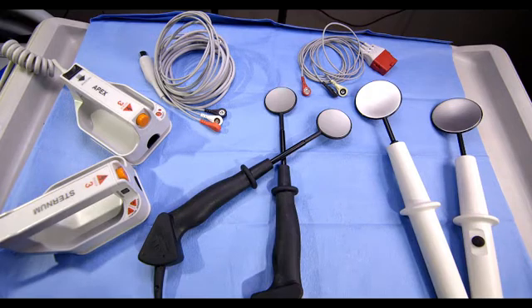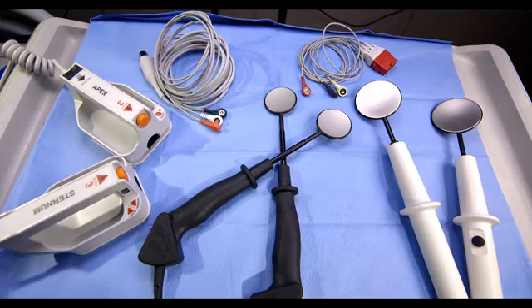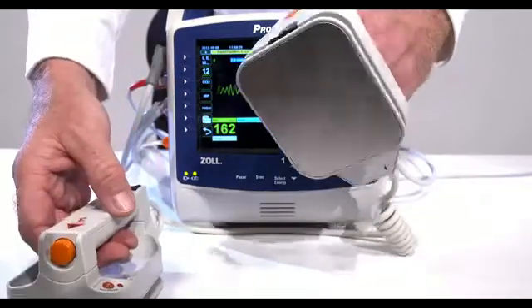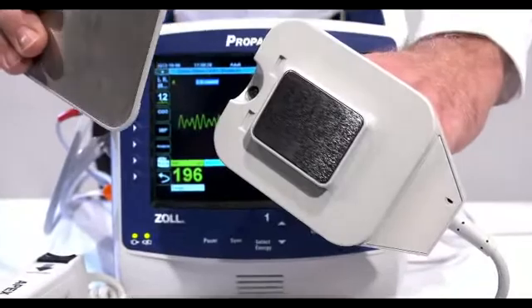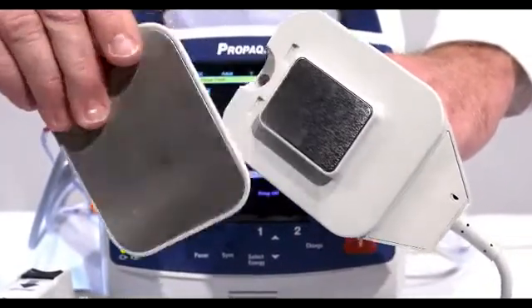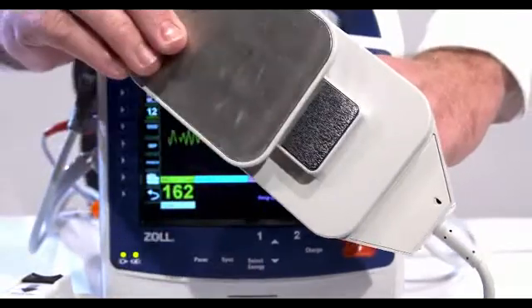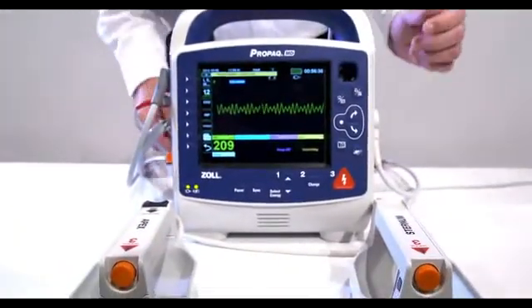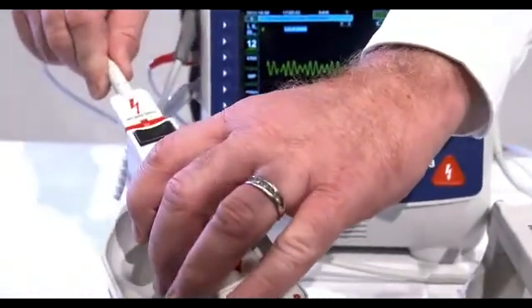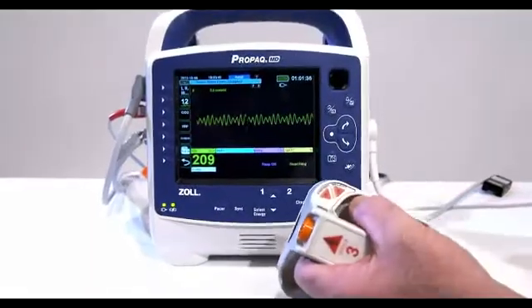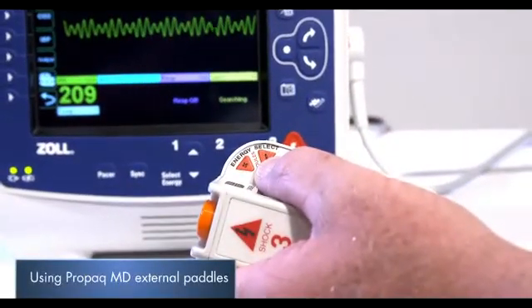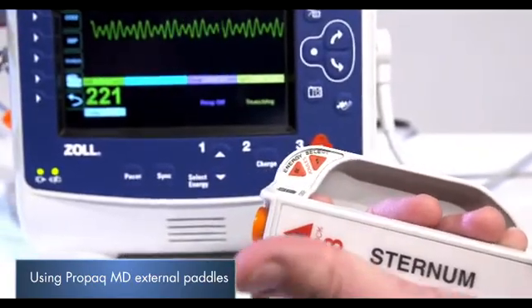Now we will focus on the use of the optional external and internal paddles with the ProPakMD. Make certain to choose the proper paddles based on the size of the patient: adult (large) or pediatric (small). External paddles are supplied with a larger electrode surface for adults. For pediatric applications, the adult electrode surface is removed, leaving the paddles in the pediatric configuration. Ensure that the paddles are connected to the therapy cable and that the therapy cable is connected to the ProPakMD unit. Press the energy select arrows up or down to select the desired energy level. These buttons are located either on the front of the unit or on the sternum paddle.